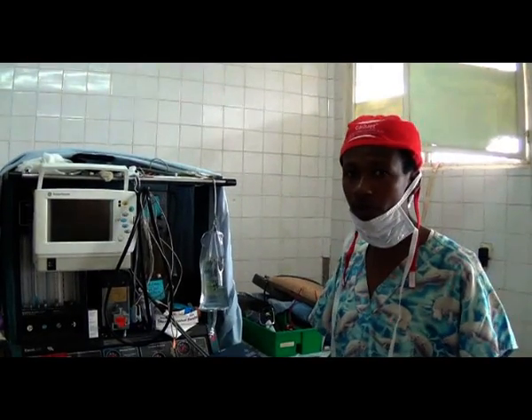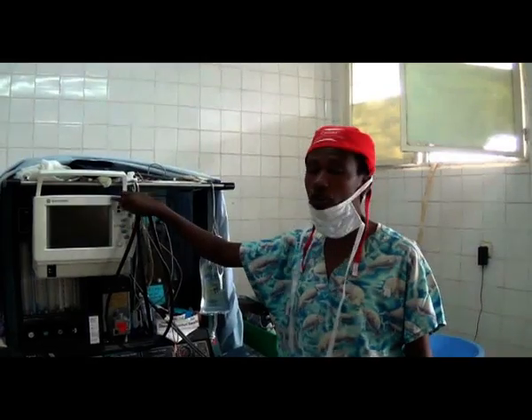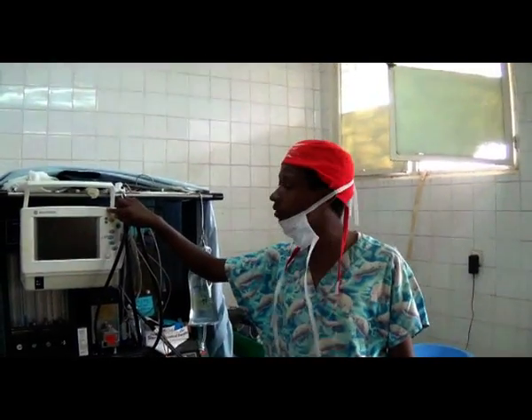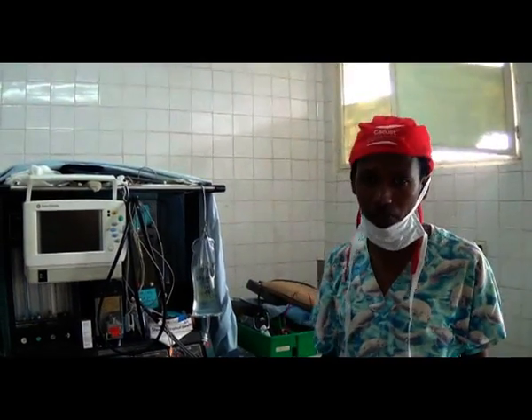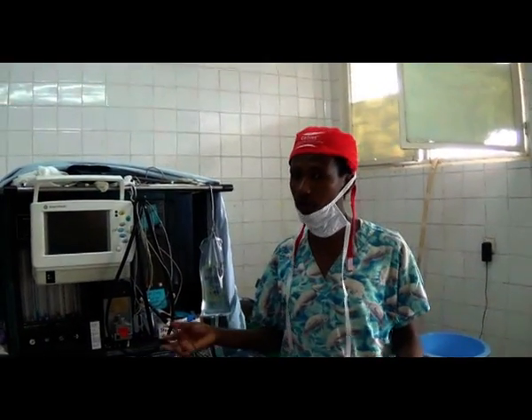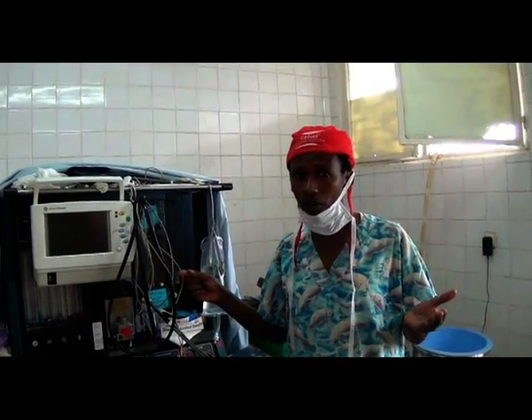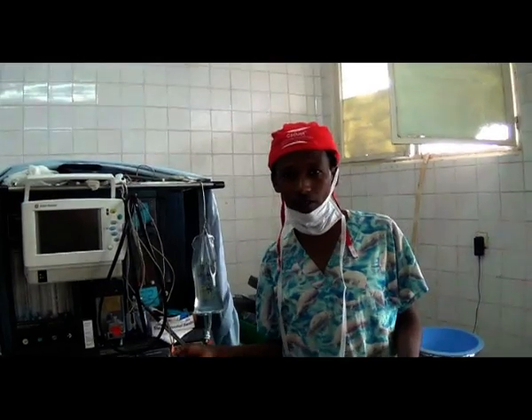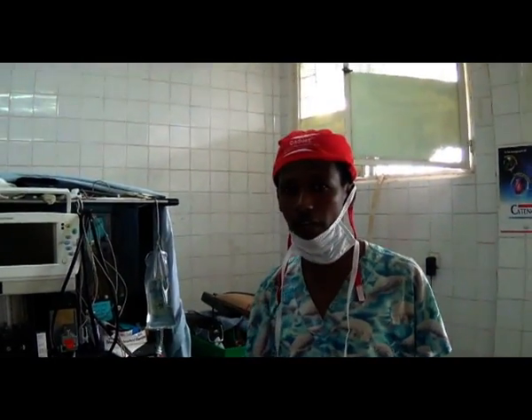Actually, not only the anesthesia machine, my monitoring also has its own problem. I don't depend on my monitors. I can't believe them because sometimes even if I have not attached it to the patient, it will read by itself. That means the machine has its own defects. I cannot detect them at this time because I'm not so familiar with the machine. I know only how to use it, how to operate it, rather than how to repair it. I'm not sure about that, but I will depend on my own techniques.